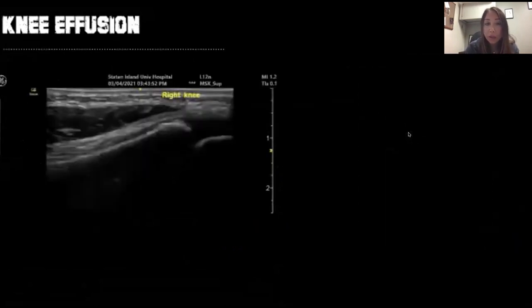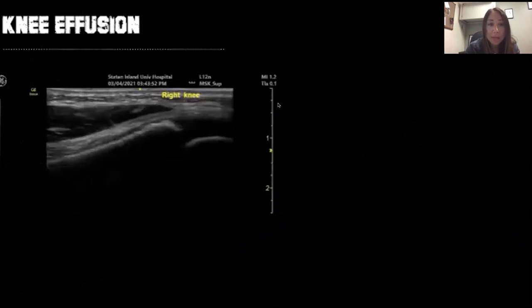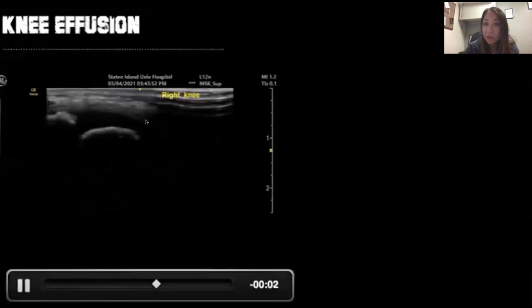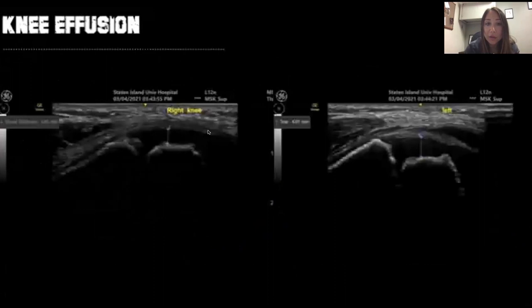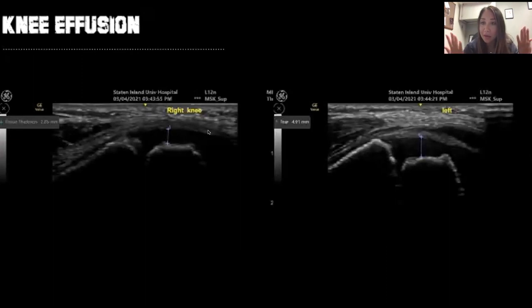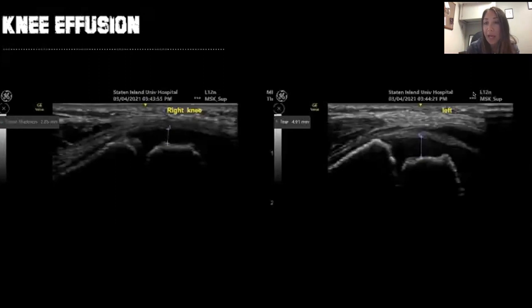On the anterior aspect, we can look for knee effusions. Effusions are fluid-filled, so they'll be anechoic, and you can measure the amount. Luckily, most of us have two of each body part, so we can always look at the normal side and compare it to the abnormal side to see if there's a difference.